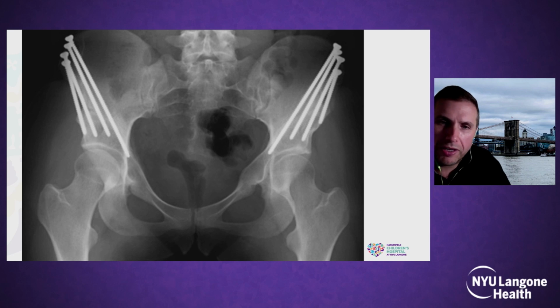And whether we moved the labrum out of the symptomatic region, whether the recovery from the PAO is significant enough to make people forget they had that initial labral pain, for whatever reason, these patients in my hands have not gone on to develop pain.